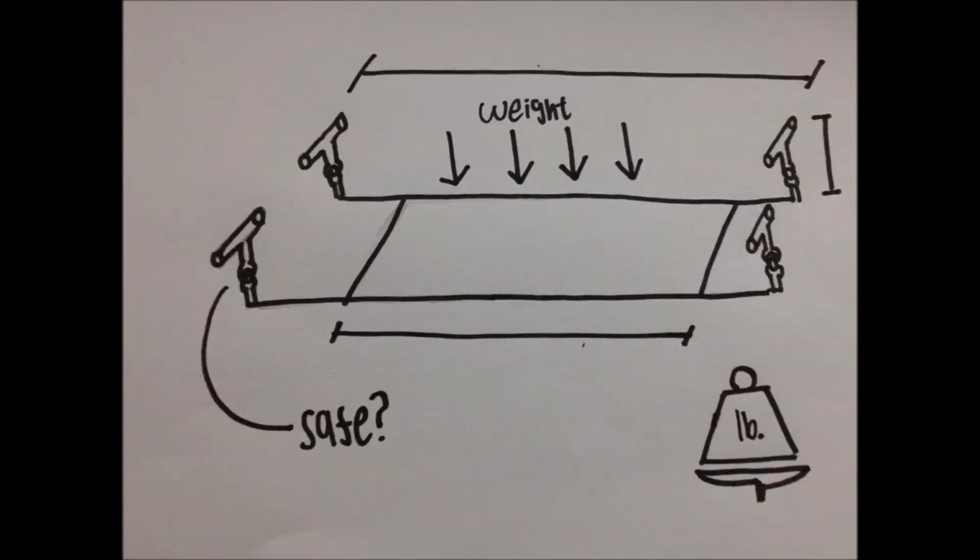Testing. The stretcher will undergo several tests to see if it's able to perform what is required of it. Weight tests, durability tests, and functional ability of the stretcher to ensure that it can be used properly and safely by the users.